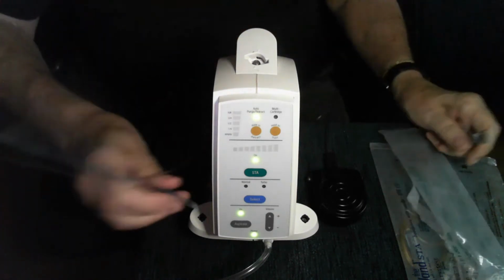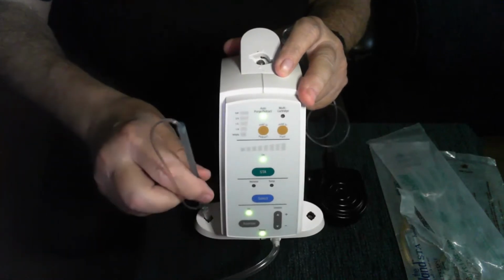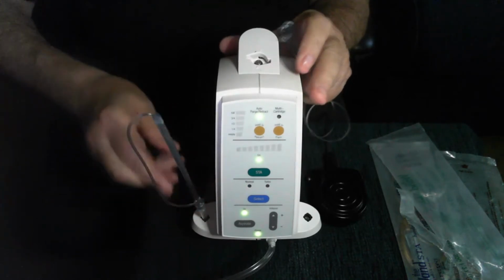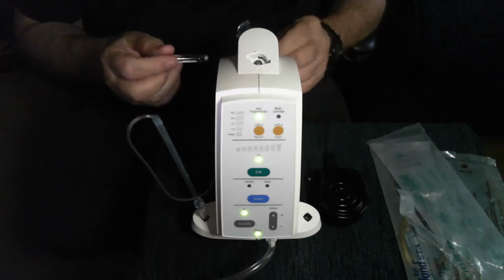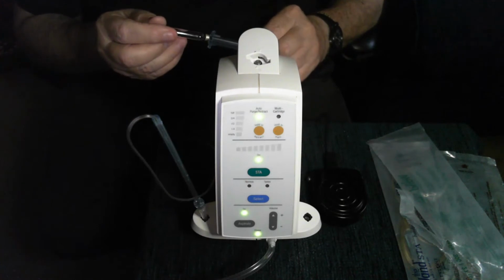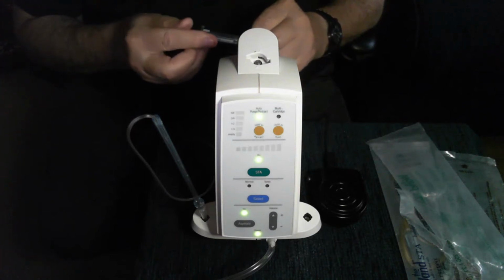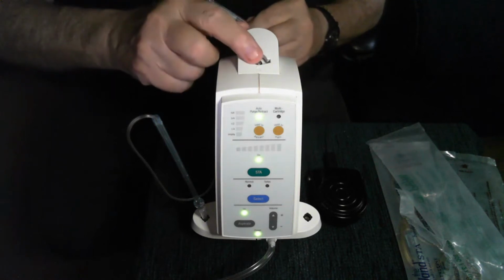And the wand handpiece fits into one of the cap holders on either side of the instrument. Pull it out directly and then leave it back in very lightly so you can use it. So you can use any cartridge of anesthetic that you wish, articaine, lidocaine, bupivacaine, any kind of drug you want, as long as it comes in a dental cartridge. If you're in a country that uses 2.2 milliliter cartridges, then we have an adapter that fits on the top of this instrument.